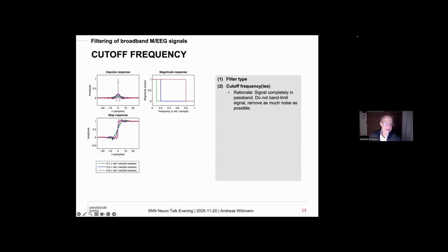So that's our different low pass filters, the step responses of different low pass filters. And you see the more high frequencies you remove, so the reddish color keeps the sharpest and removes the smallest amount of high frequencies. And the more high frequencies I remove, the more shallow the step becomes in the time domain in the filter output.